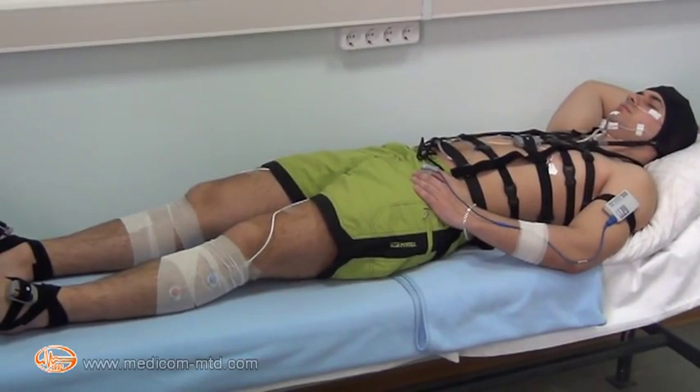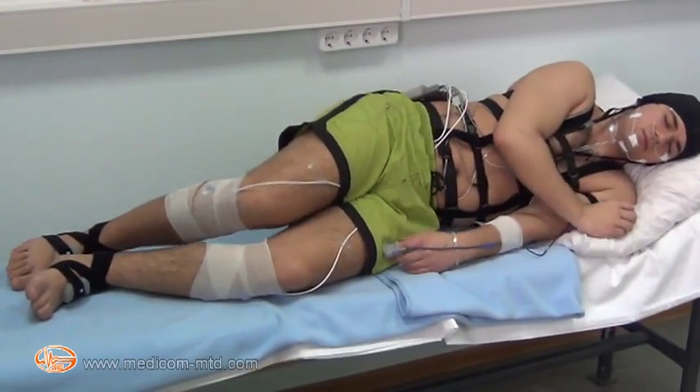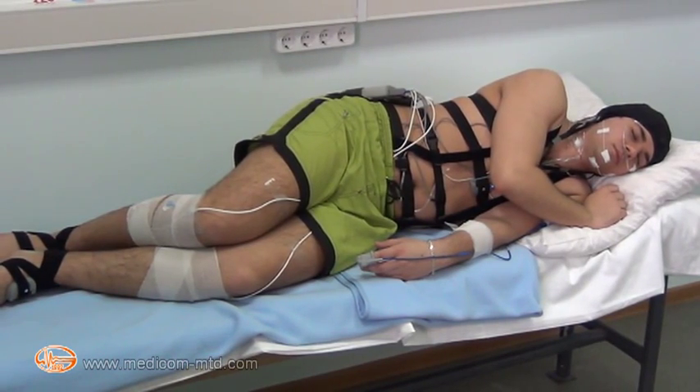The patient is positioned supine. Sensors are additionally fixed with elastic bandage. On the patient's face there are two sensors of electrooculogram and two myographic sensors on the chin.